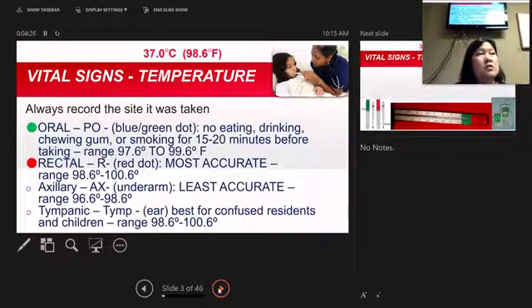And the video is going to show you when you do a tympanic temperature, you pull up on their earlobe. And when you pull up, stick it in and press the button. Okay? It actually has to go into the ear canal because you're trying to get it on the tympanic membrane, which is inside the ear canal. If you're getting a child or an infant, you pull down on their earlobe and stick it in. And it's just the difference in the way that the eustachian tubes are pointing.